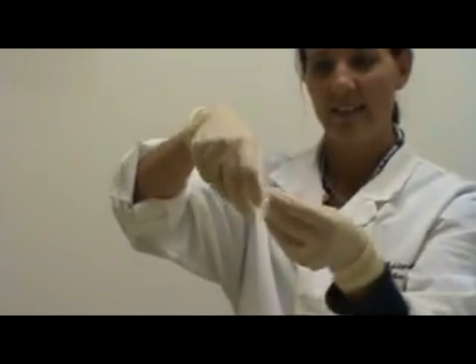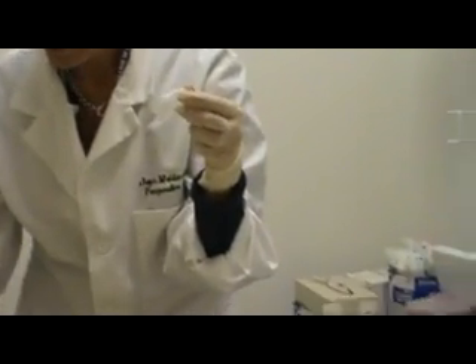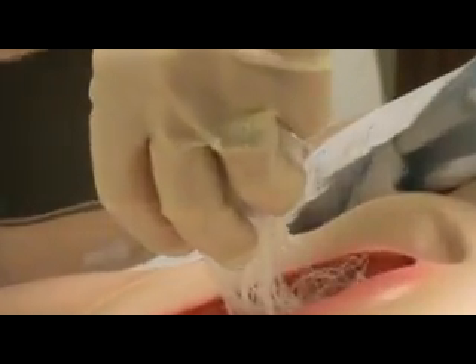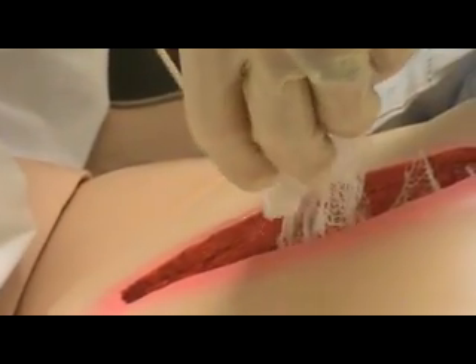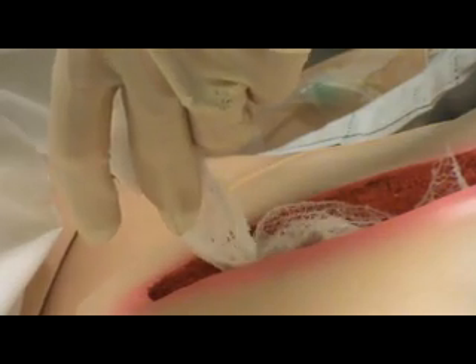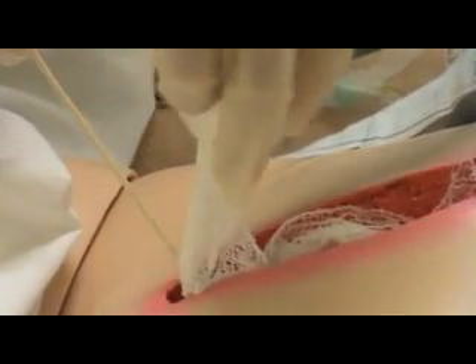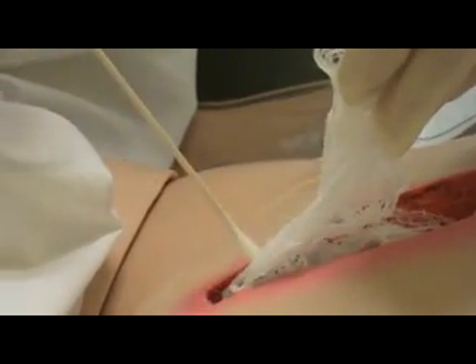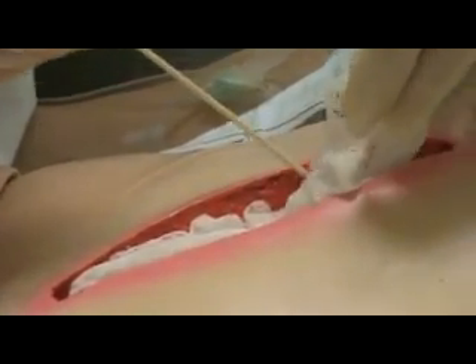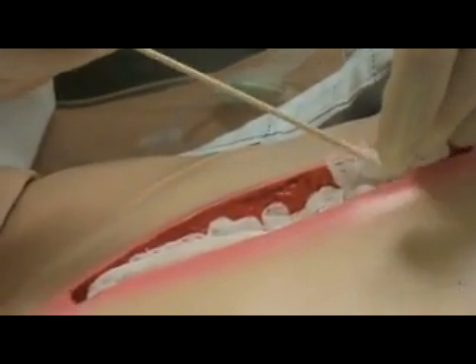This is always very tricky — you're kind of opening that up, not just clumping it, because it's got to be kind of fluffy. Then I just put it in my left hand because I am dominant with my right. I'm going to pick up my sterile cotton tip applicator and I'm going to start — going exaggeratedly slow here — very carefully put it in the wound. Again, you don't want to jam it in there. You've got to be careful not to touch the skin, because you don't want to get saline on the good skin, as that could also damage it — just like when you sit in the bathtub too long.